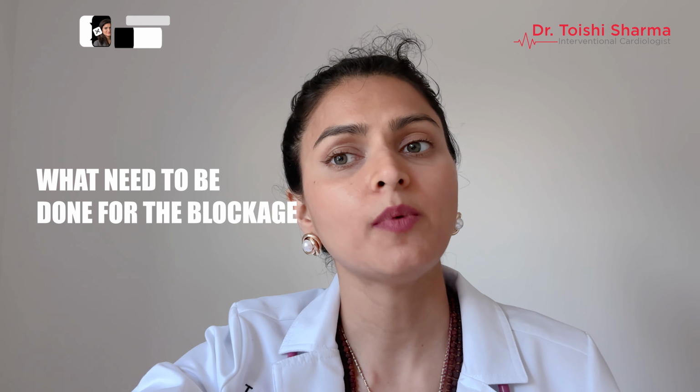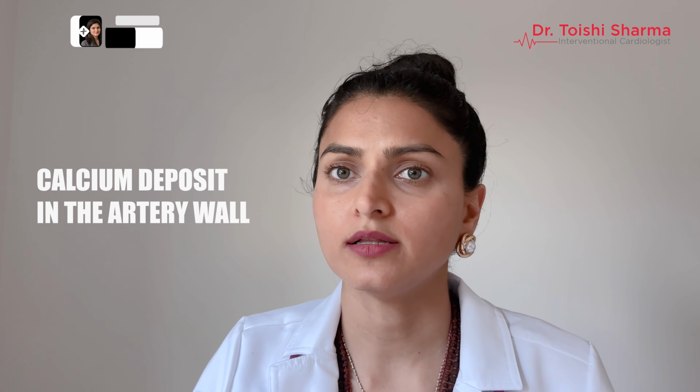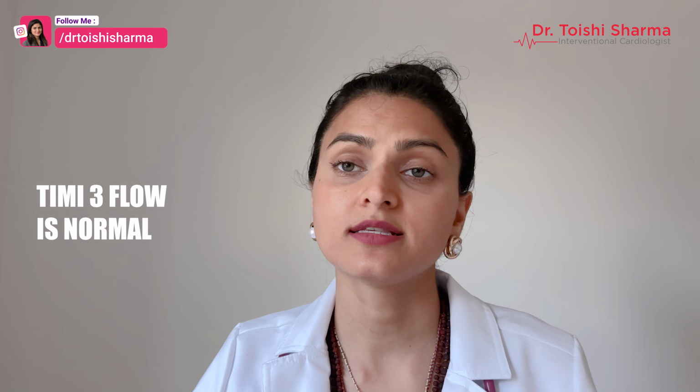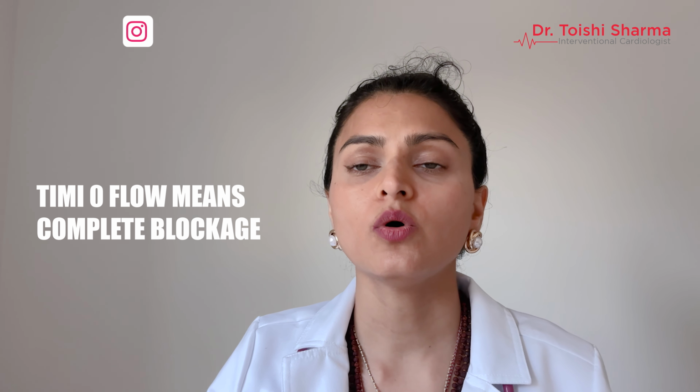And finally, you may also see terms like diffuse disease, which basically means that there are long segments of narrowing in that particular artery. You may see a word like calcification, and this means that there is hard calcium deposit in the artery wall. You may also see a word like TIMI flow. So this is an assessment of how well the blood is flowing through the artery. TIMI 3 flow is normal and TIMI 0 flow means there is complete blockage.